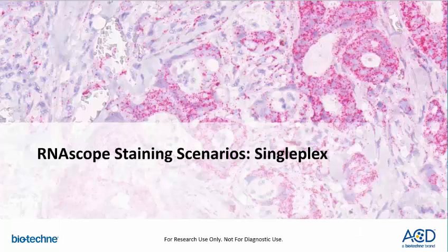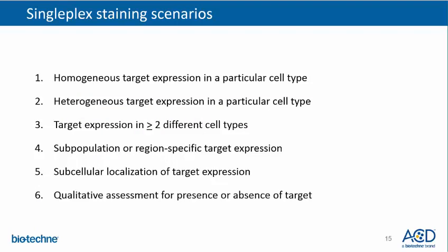Next, we will discuss the data analysis for different staining scenarios that could result from the Singleplex RNAscope assay. And these are the 6 Singleplex staining scenarios that we will go over.